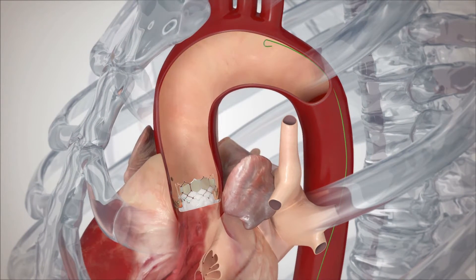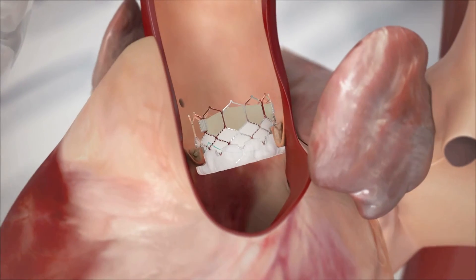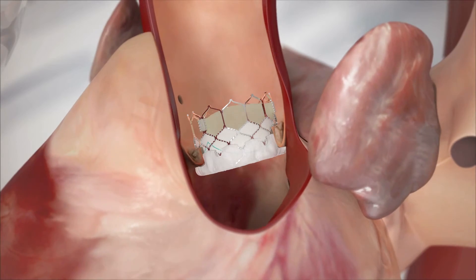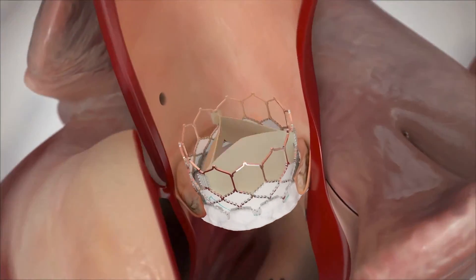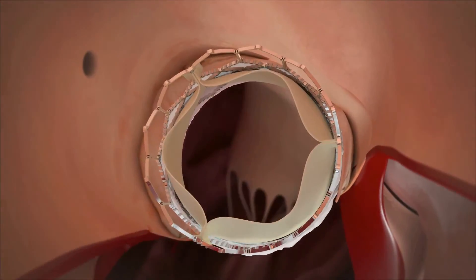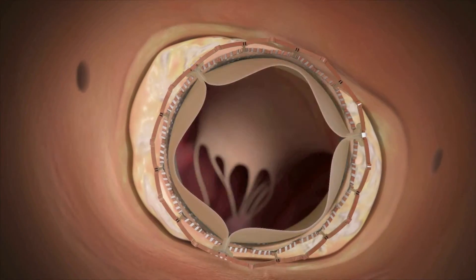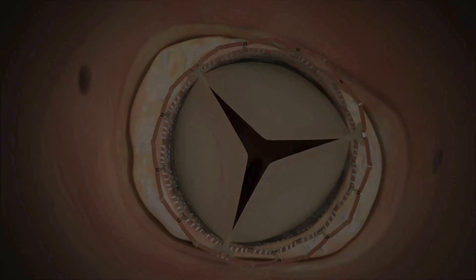Once the deployment balloon is deflated, the new leaflets start to function normally within the expanded stent frame. All the equipment is withdrawn and the valve is assessed to make sure it is working well, with no blockage to the coronary arteries, no leak causing aortic regurgitation around the valve ring, and no injury to nearby structures.